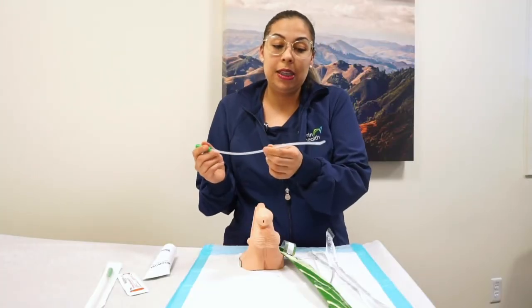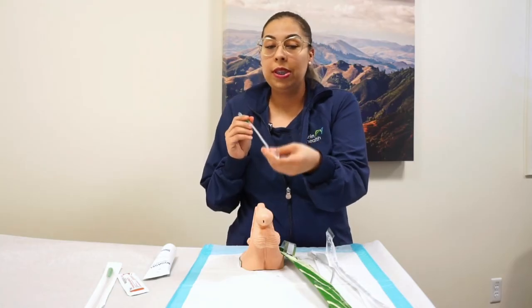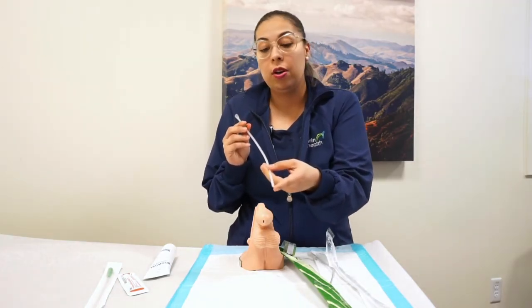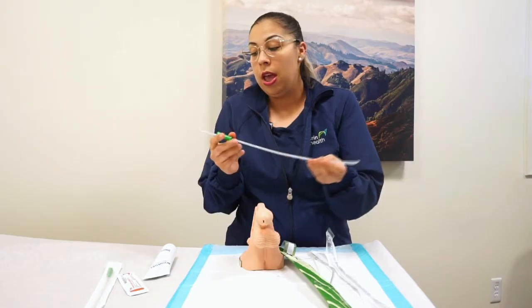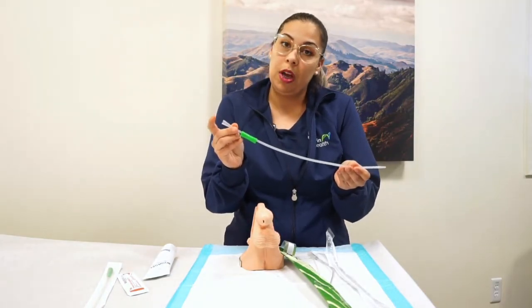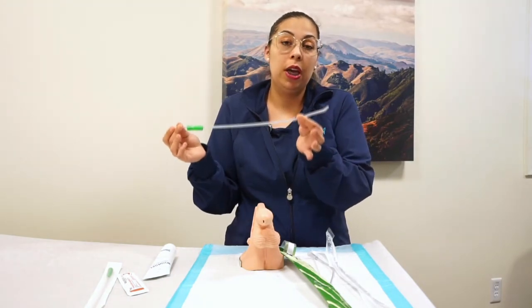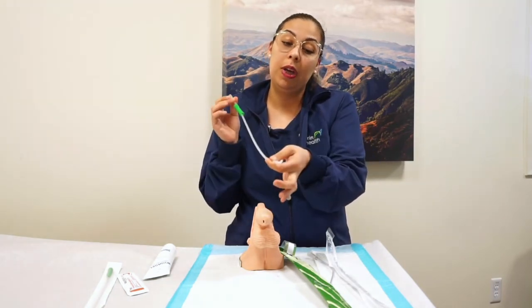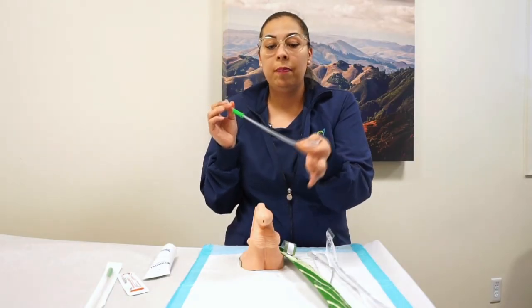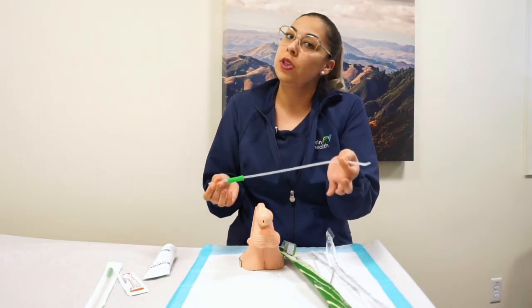It's basically the same thing. They have a curve on the tip of the catheter and you're going to do the same thing. Make sure that the curve is up, and they have the little neck on the top of the catheter. Always make sure that when you put the catheter in, the tip is pointing up, so that way you're making sure you're going to pass your prostate and you're not going to damage yourself.